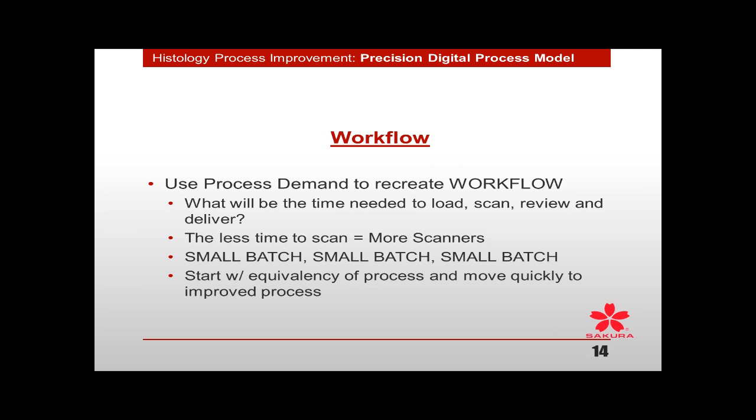Most often, once you come up and you say, I've got X amount of slides and I need this kind of time constraint, less time to scan, that usually means more scanners. That can be very costly and can be a big obstacle for you. Most scanners are not very inexpensive, so if it's saying that I need 4 or 5 or 6, you're lucky if you're going to get 1.